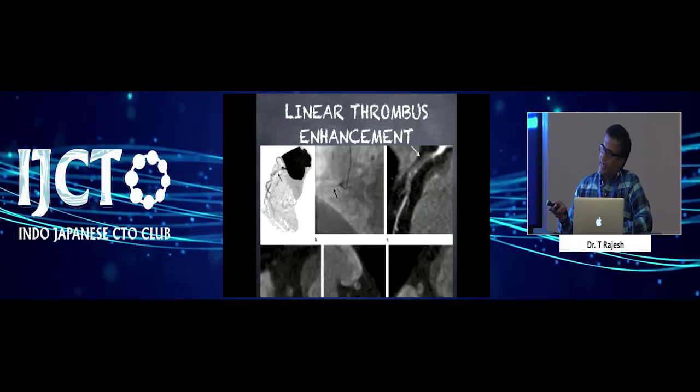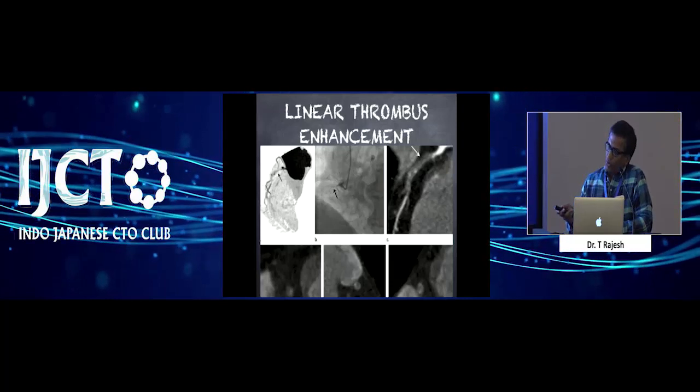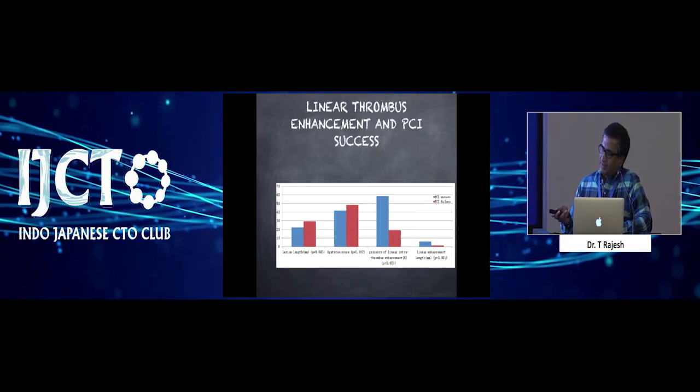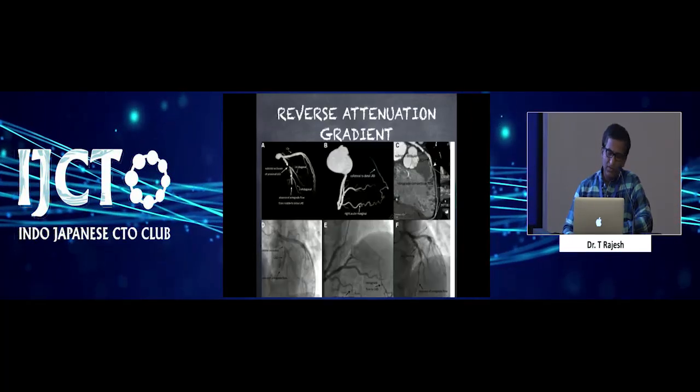This CTO can be recanalized very easily if you have linear thrombus enhancement on CT scan. This is again a study which shows that if you have linear thrombus enhancement, the success of CTO recanalization is on the higher side compared to no linear thrombus enhancement.